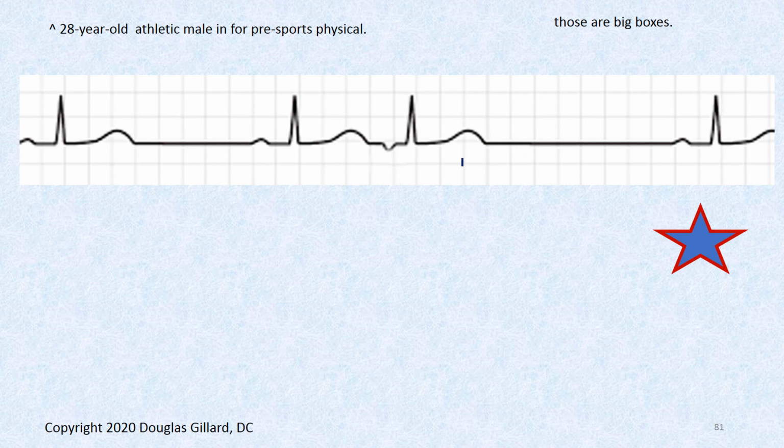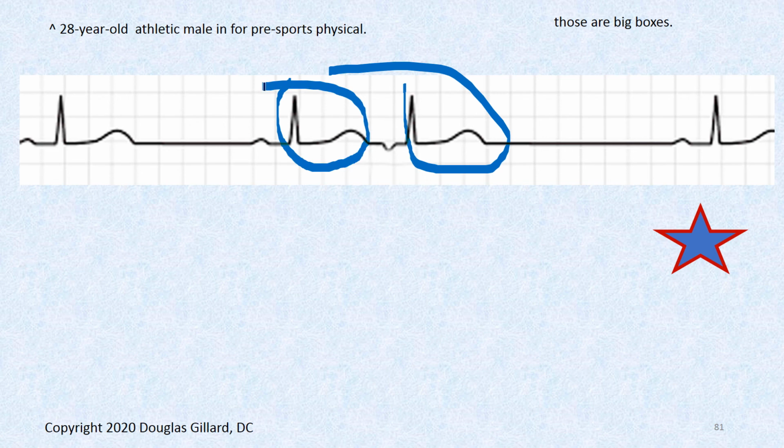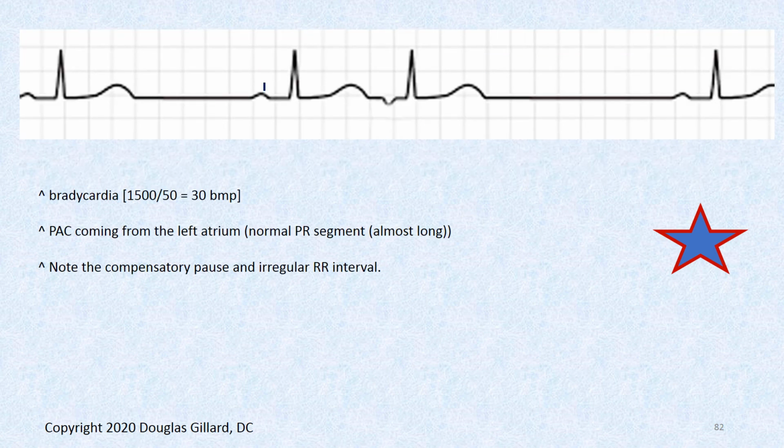But notice that here's the mess up, right? The atria were told to contract via a different master, not the SA node, but by an action potential. But once the signal gets through here, there's the slowdown portion of the AV node. We have a normal QRS complex and a normal T wave. This looks exactly the same as this. That's kind of the point of that.